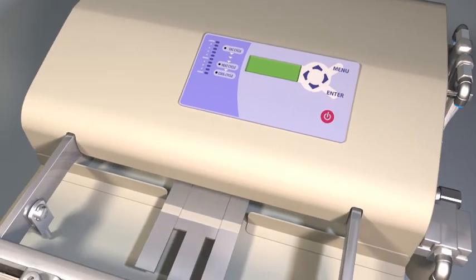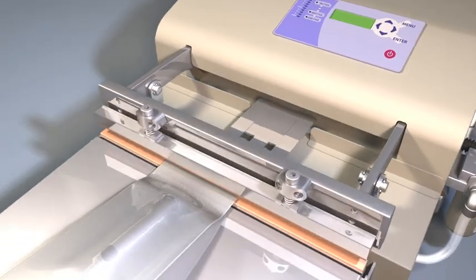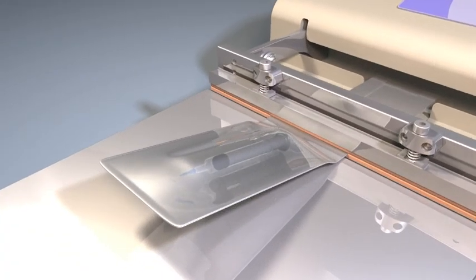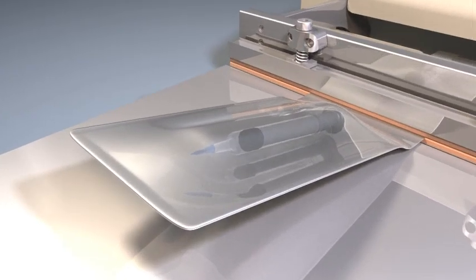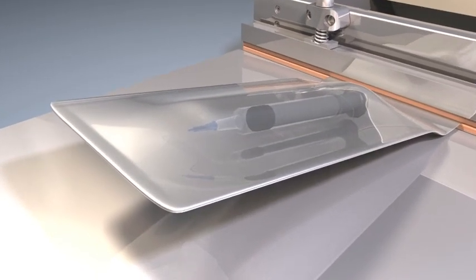The operator simply activates the foot switch, and the sealer will pull a vacuum to the unit's pre-programmed value. Once this environment is achieved, it will automatically withdraw the vacuum nozzle and begin the sealing process.